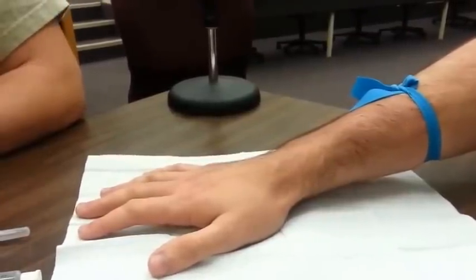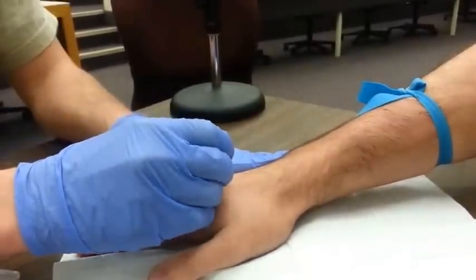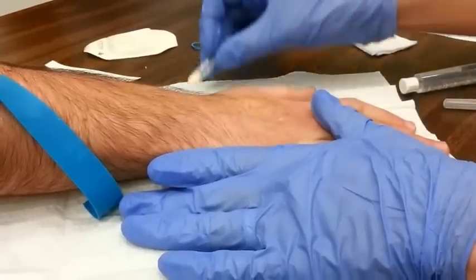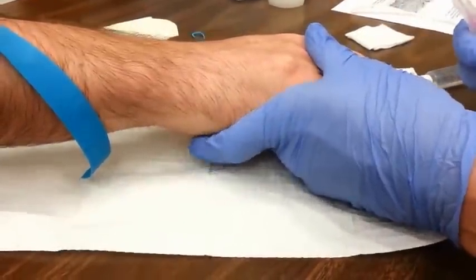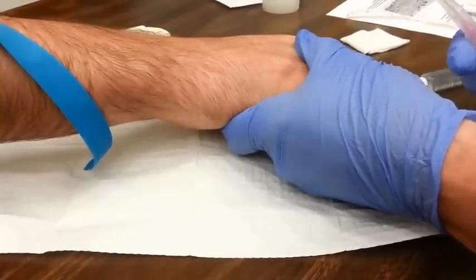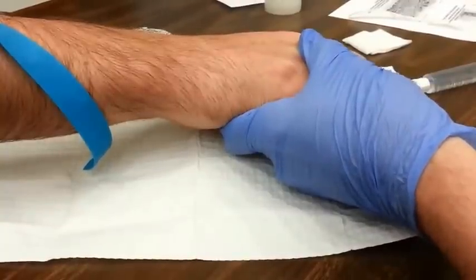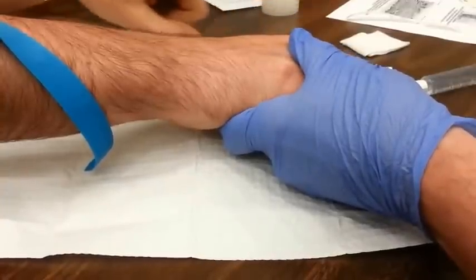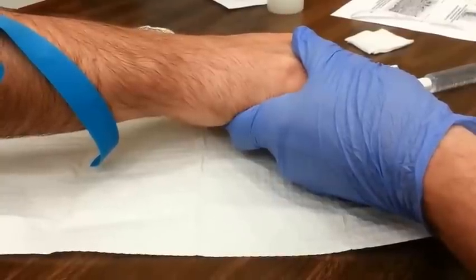You'll want to cleanse the skin over where you will introduce the needle to prevent any infection once you break the skin surface. Once you have found your vein, you'll most likely want to anchor it. Veins are mobile and tend to roll around, so anchoring a vein will help you when inserting the needle. To do this, grab with your non-dominant hand a few inches distal to the vein. With your thumb, apply some skin traction distal to the site, meaning you are dragging the skin away from the site of puncture. This reduces the number of rolled veins and will make you look like a seasoned IV start veteran.